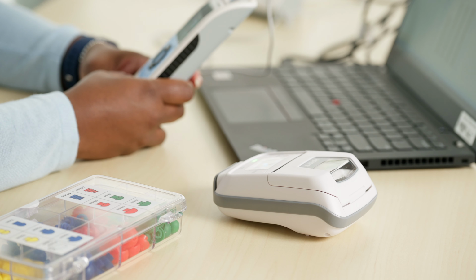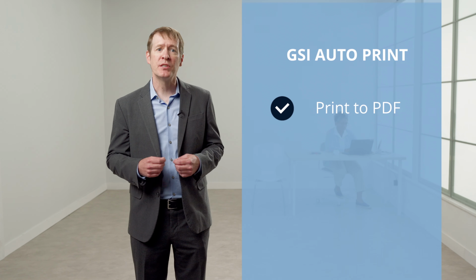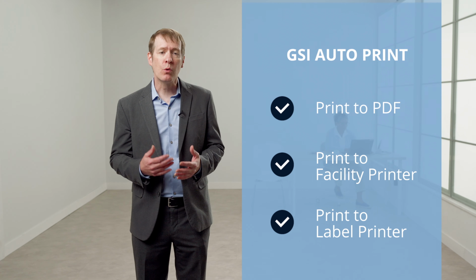GSI AutoPrint software application is used for printing purposes only and can be used instead of Data Manager. AutoPrint can be configured to print to PDF, print to a facility printer, or print to a label printer. When the Corti is connected to the PC, AutoPrint will automatically print all tests held in the memory.